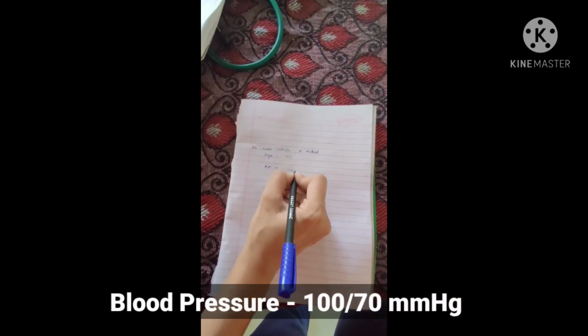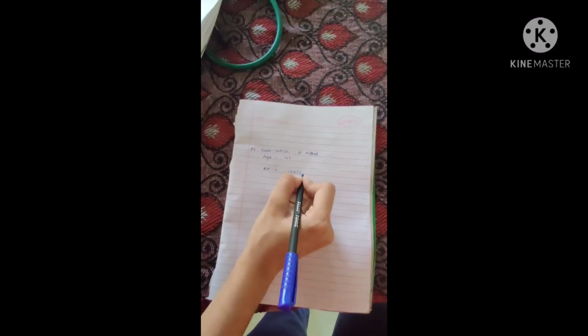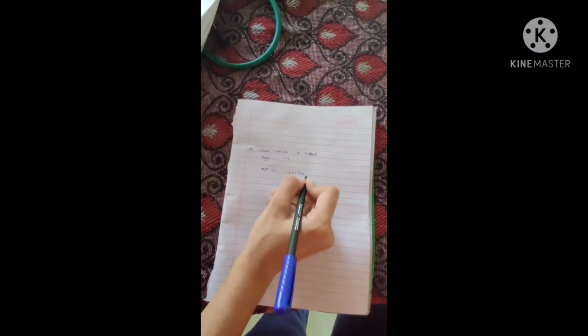Here, the determined blood pressure is 100/70 mm of Hg. That is, 100 is the systolic blood pressure and 70 is the diastolic blood pressure.